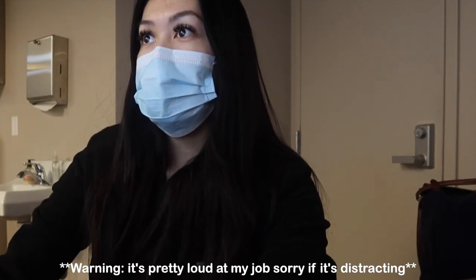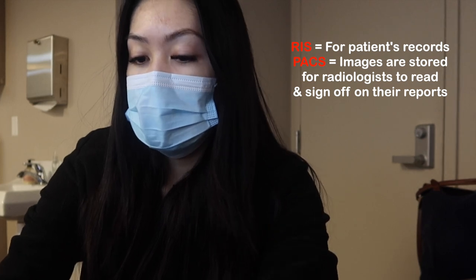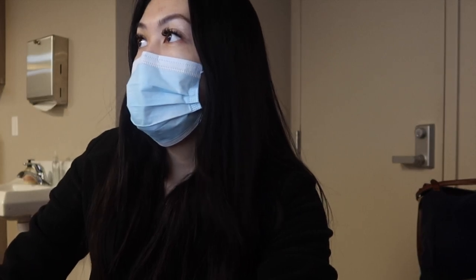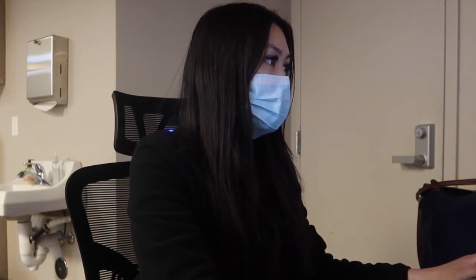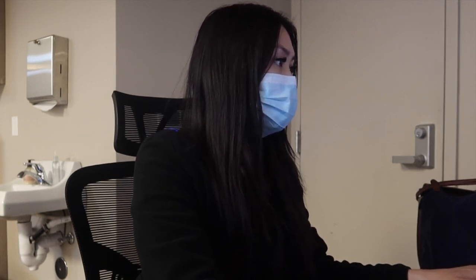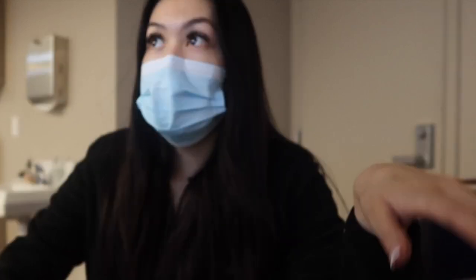Hey guys, good morning. I am just setting up for the day and logging into my workstation right now so I can get started. I'm going to set up the next patient's information so it's ready when they get here. Then I need to open the door and unlock it — my table is already set up and everything.